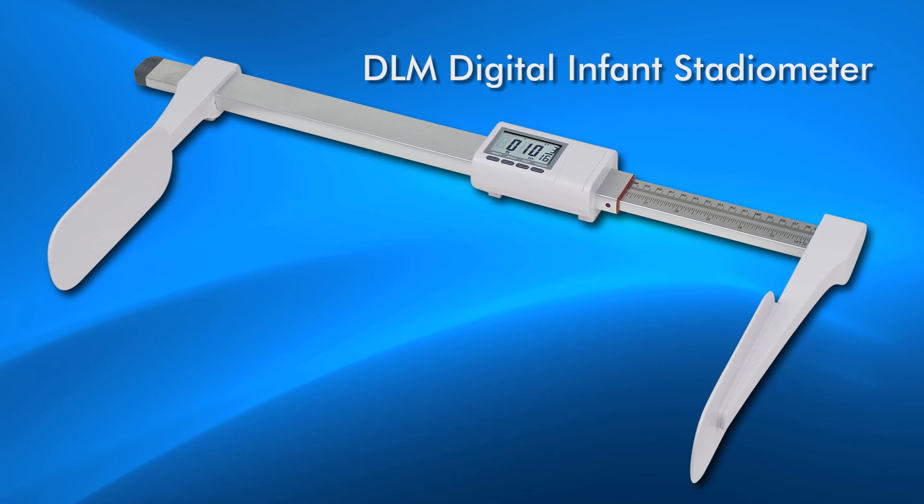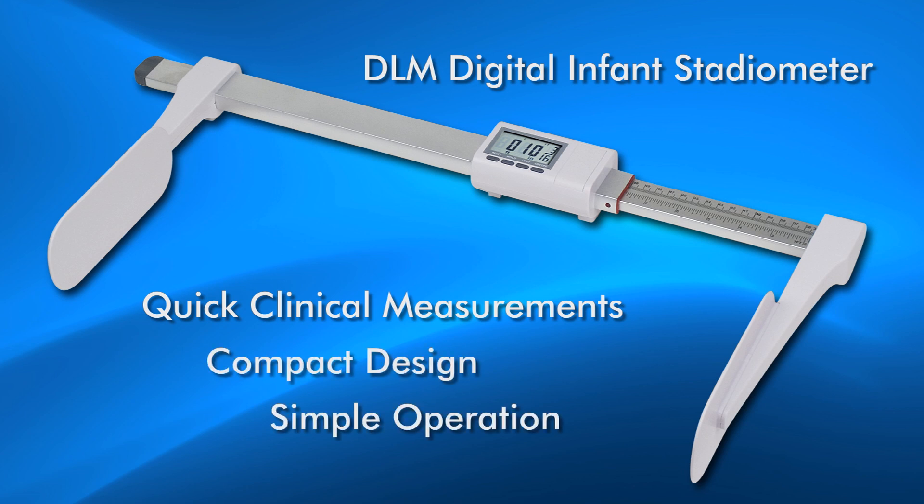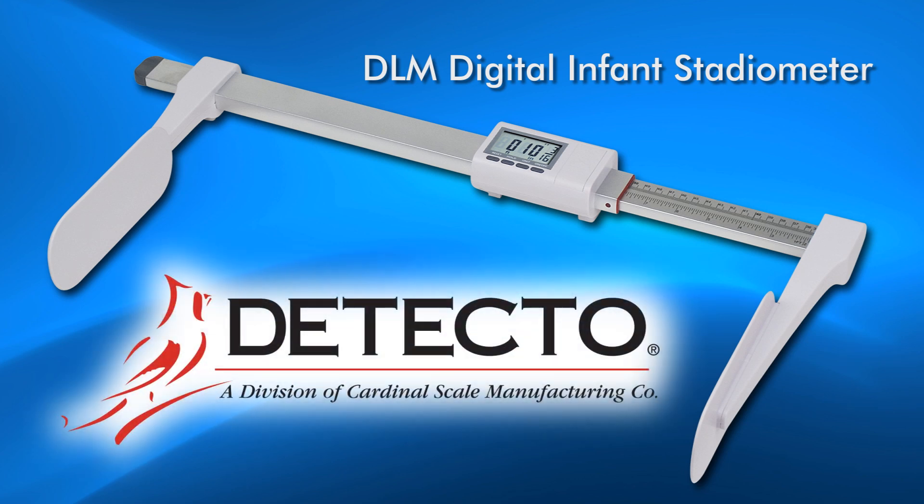Detecto's DLM Digital Infant Stadiometer is a perfect solution for obtaining quick clinical measurements of newborns and infants with its compact design and simple operation. Detecto, providing clinical grade accuracy since 1900.